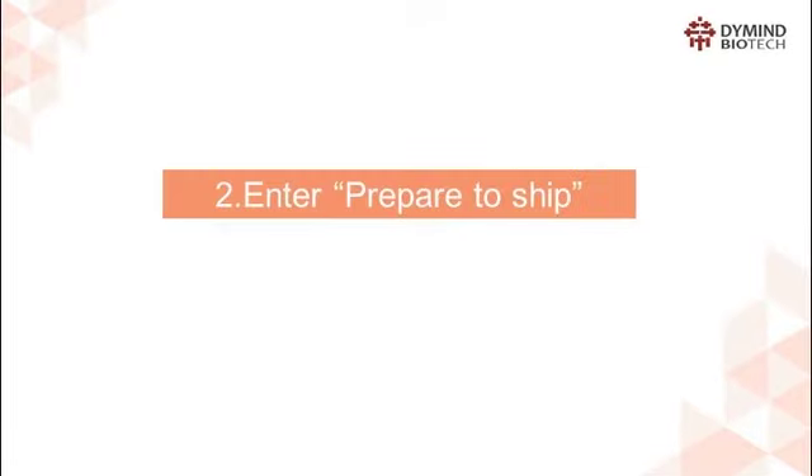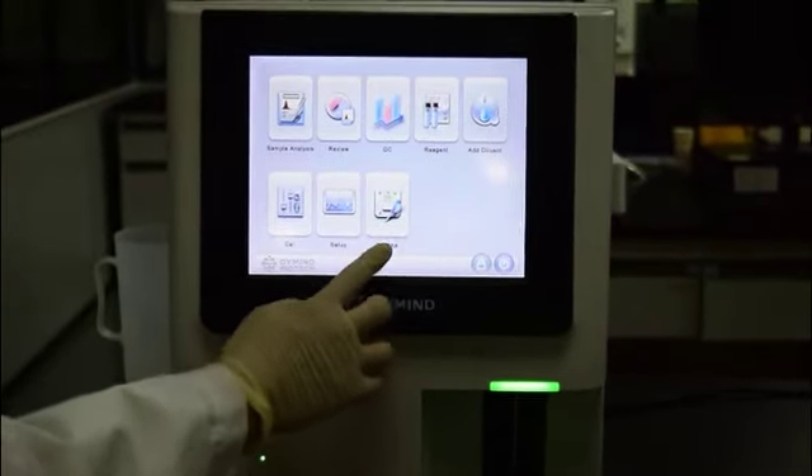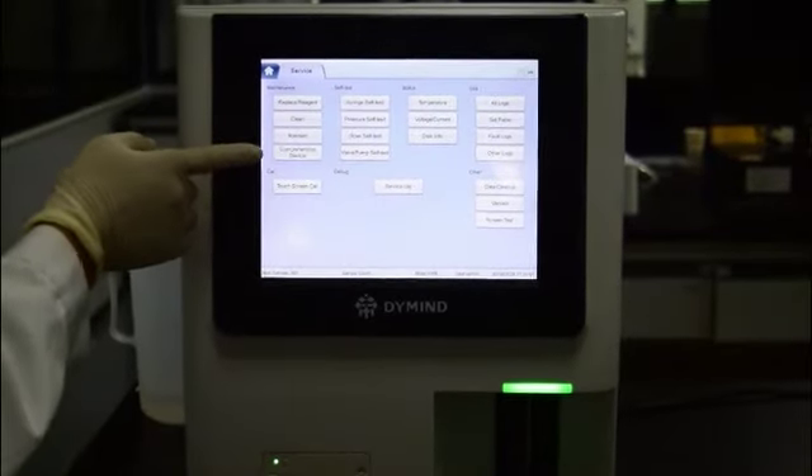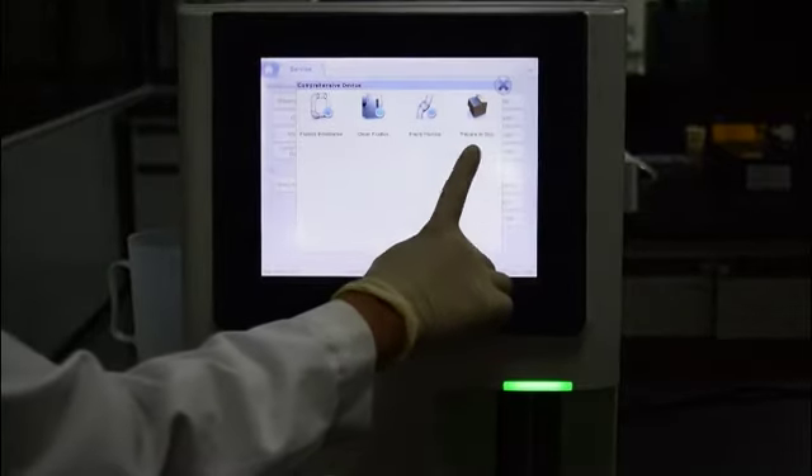Step 2: Enter Prepare to Ship. Click the service icon in the main menu, then click Comprehensive Device in the maintain icon. After that, click the icon of Prepare to Ship, then click Yes to proceed.